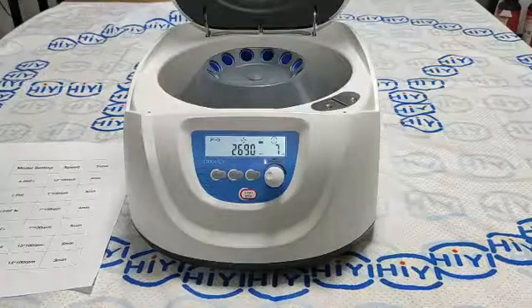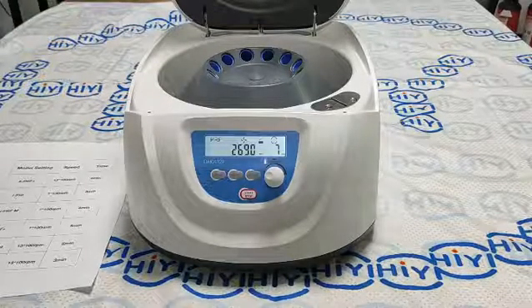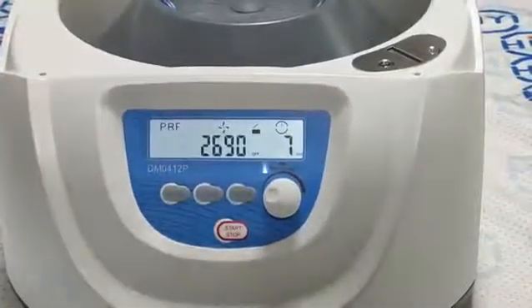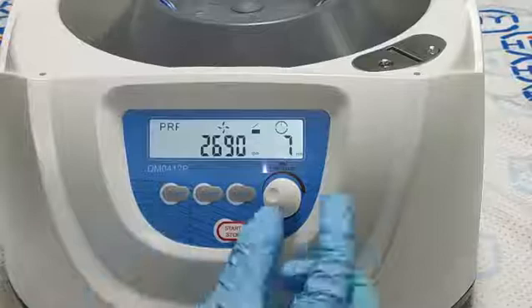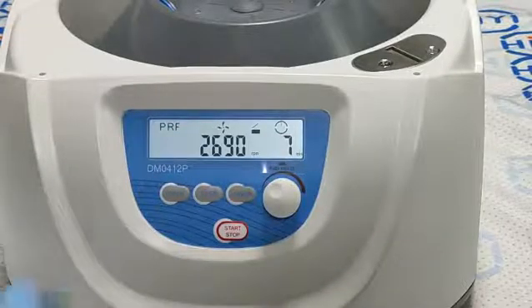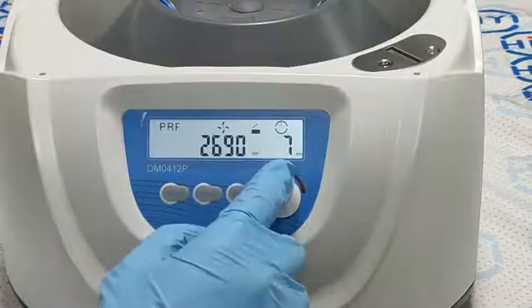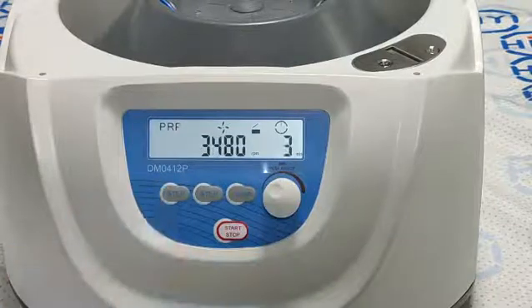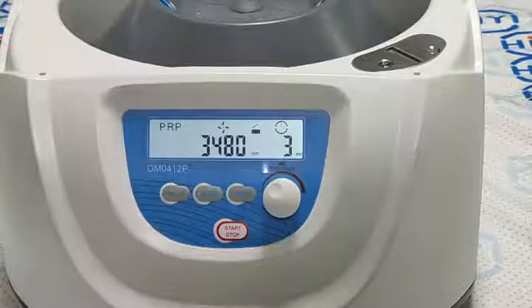It has a PRF program. Its speed is 2690 rpm and time is 7 minutes. Then we press the PROG button and we can select the PRP program. Its speed is 3480 rpm and time is 3 minutes.